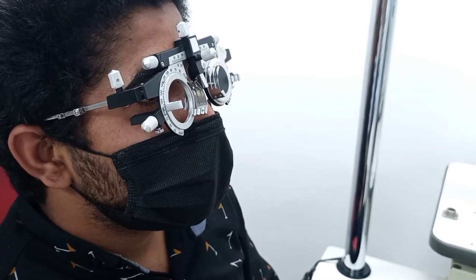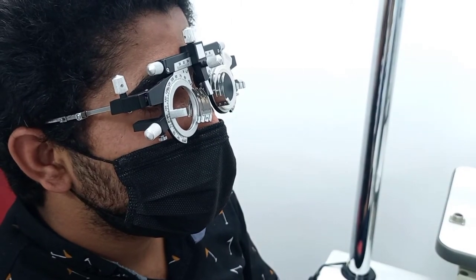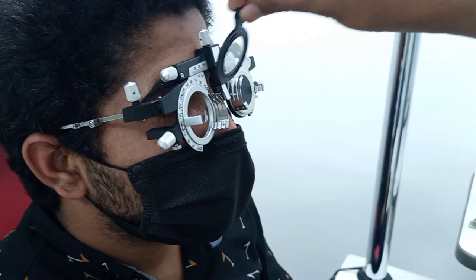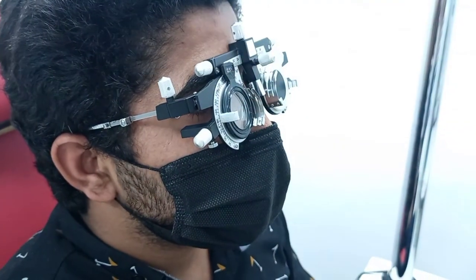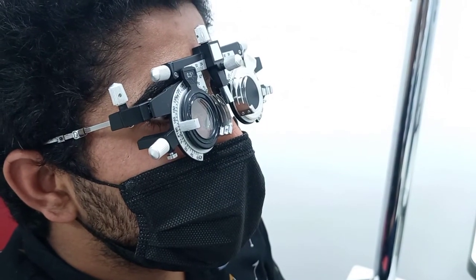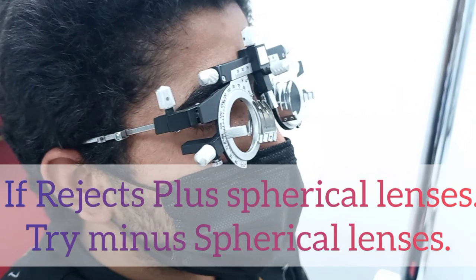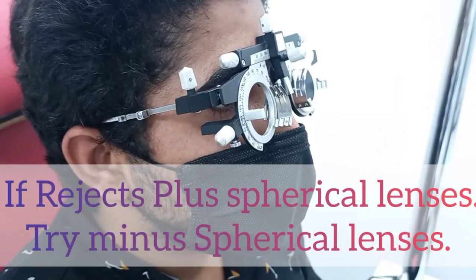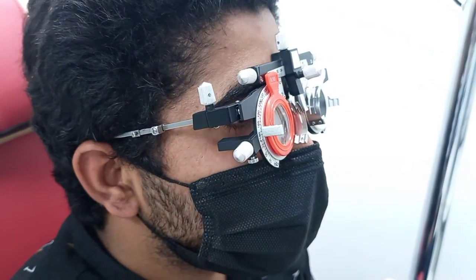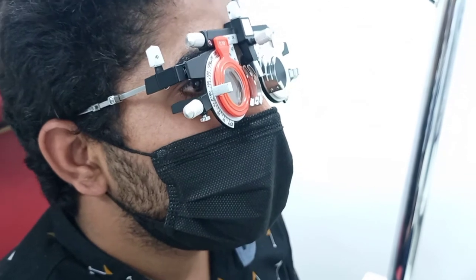I will place lens number one, which is plus 0.50 spherical, and ask the patient if the visual acuity is improving. The patient says no — the plus spherical is rejected. I then place lens number two, minus 0.50 spherical, and ask again. The patient confirms the vision is improving.